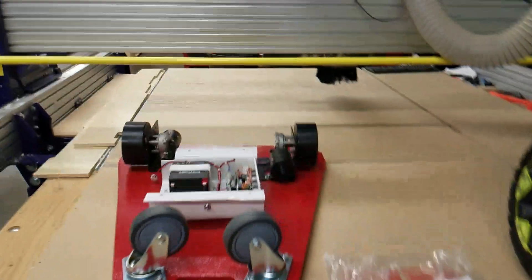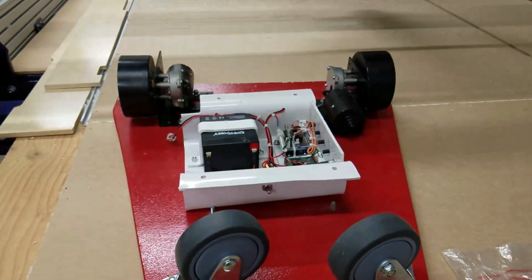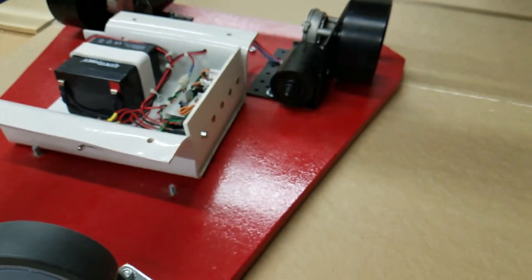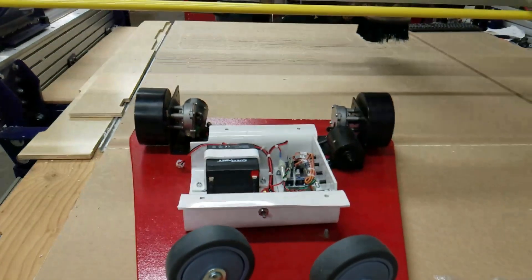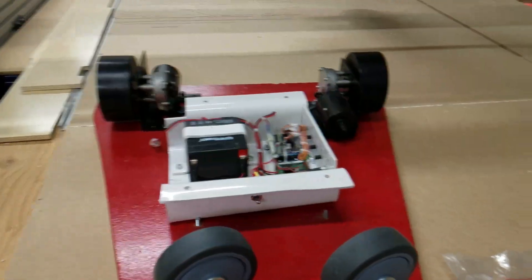This is very similar to a product we've made in the past: this power scooter, which is an early mobility device for kids with disabilities. We use switches that plug into mono ports — just like a lot of switch-activated toys — to drive direction and movement.